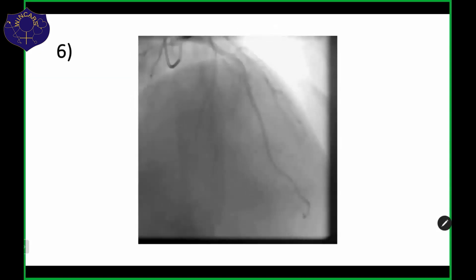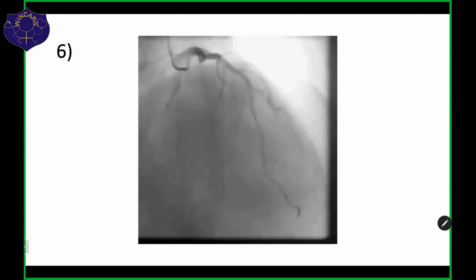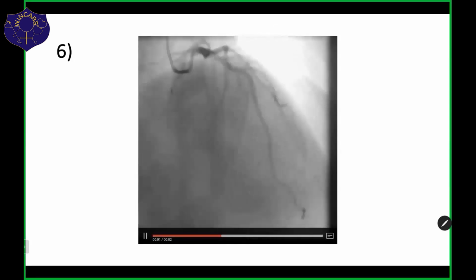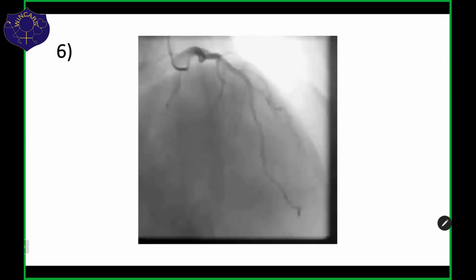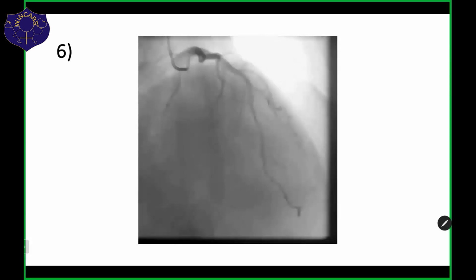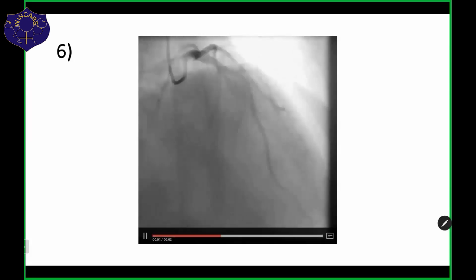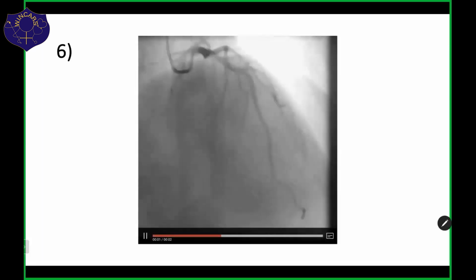This is a young person who again had a positive TMT, for whom we did an angiogram. What's showing here is a mid-myocardial bridge. I just wanted to highlight the necessity of having electrocardiogram-gated coronary angiogram pictures, where most of the analysis should not be done during systole, it should be done during diastole. During systole, most of the time, a non-significant lesion can be wrongly interpreted as a significant lesion. So this is one of the examples where we should be very careful when giving a diagnosis of significant lesion, and we should always look at the ECG also before we give a decision in borderline lesions.